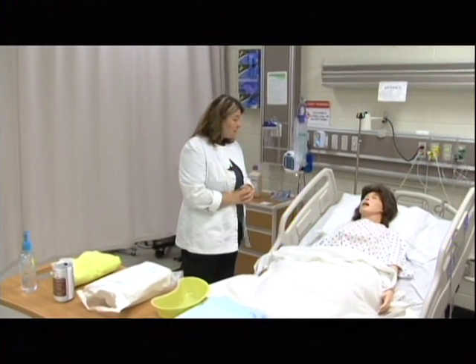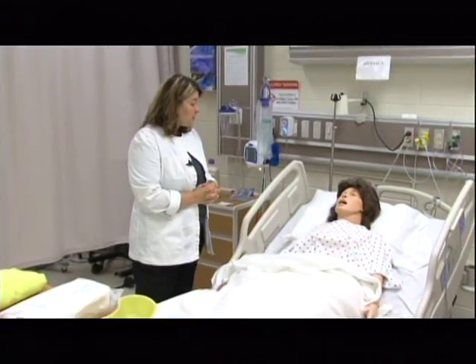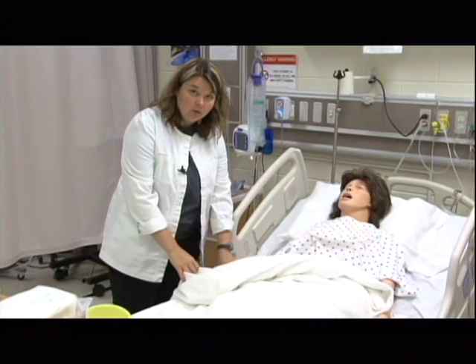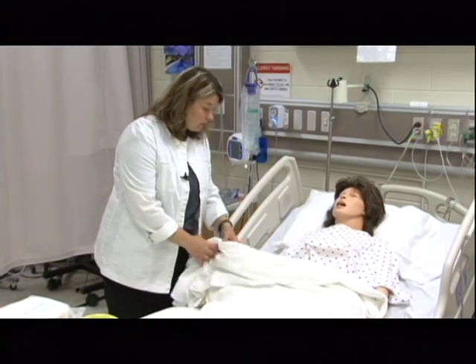Good morning, Mrs. Smith. How are you doing today? My name is Heather. I'm going to be your nurse. Can you please tell me your name and date of birth? And as I ask her to repeat that, I'm going to look at her armband, and I'm going to confirm with 2 patient identifiers that what she's telling me matches her armband.